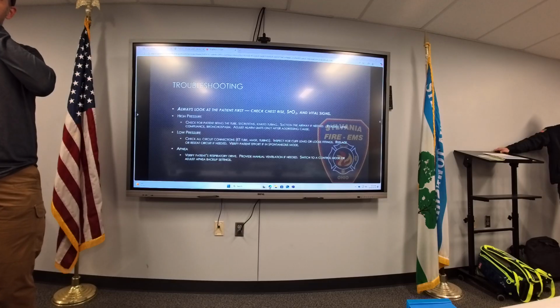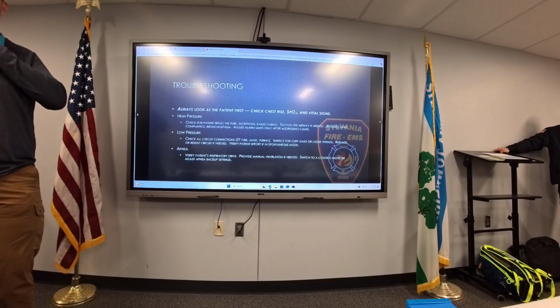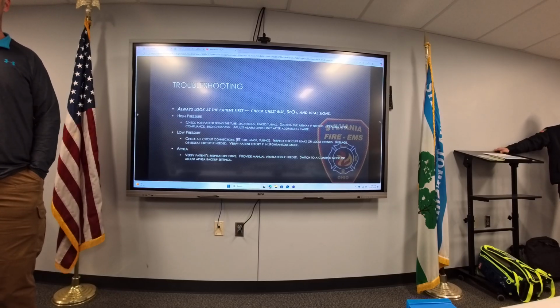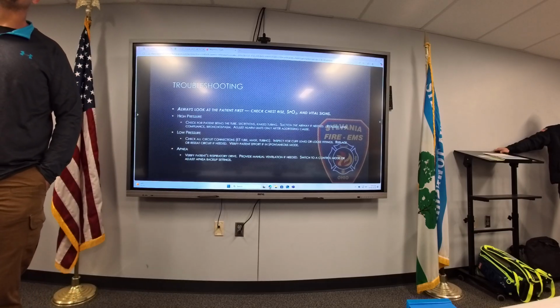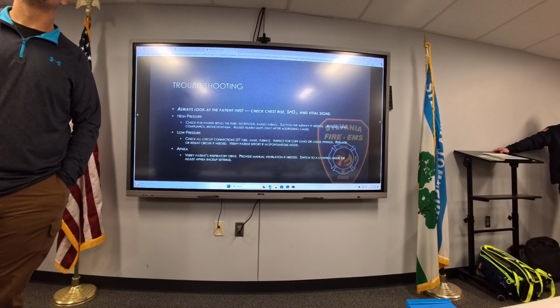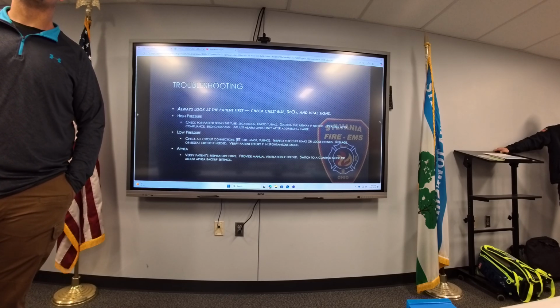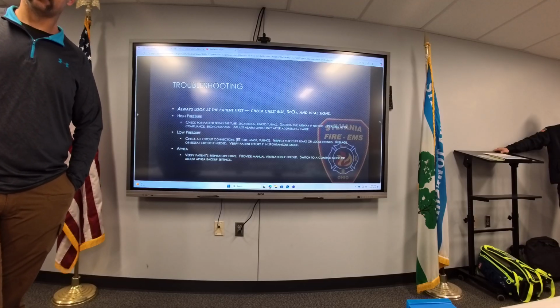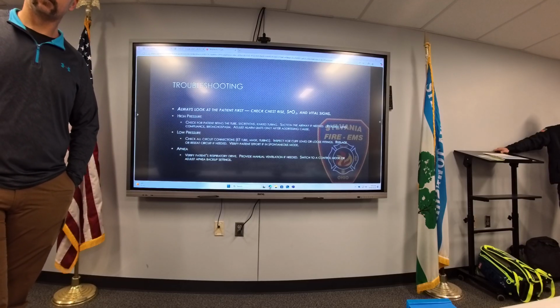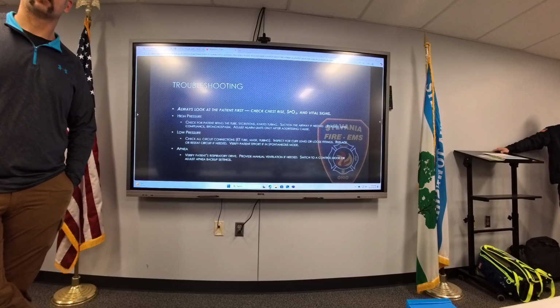Gotcha. So rescue pods, we don't use those. We were using those during Lucas County days. Obviously, auto vents, we were using those compared to these. We're able to alter these a little bit more. This is 100% anecdotal, because it feels like we're getting more ROSC. I don't know if they're walking out of the hospital more or not, but it does feel like we're transporting with a pulse more often than we were in Lucas County.